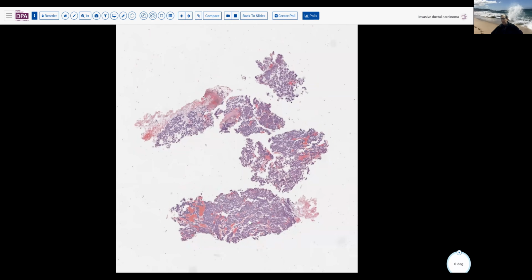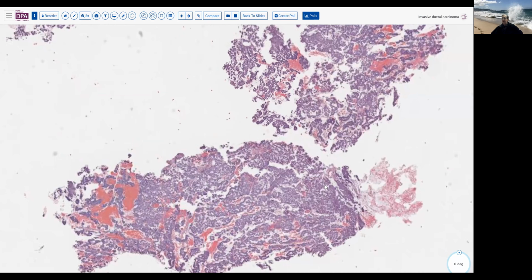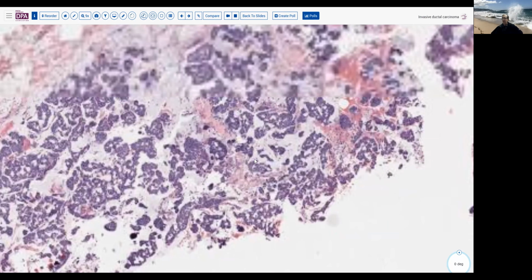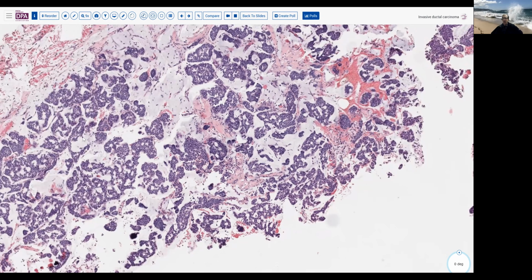Now, occasionally you'll get to higher cellularity, and that certainly may not have quite the same prognosis, but here you're still seeing abundant mucin in this tumor with the tumor cells floating in the mucin pools, rather than being sort of tissue invasive and then producing mucin. So that is the feature we would tend to use more, is tumor cells sort of floating in a mucinous background as opposed to invading primarily.